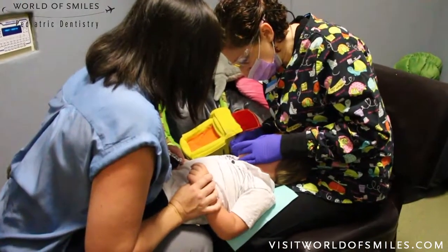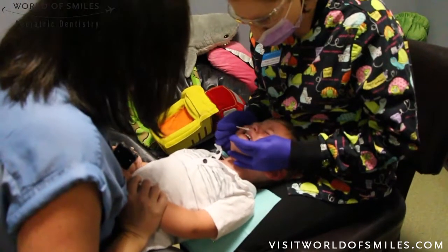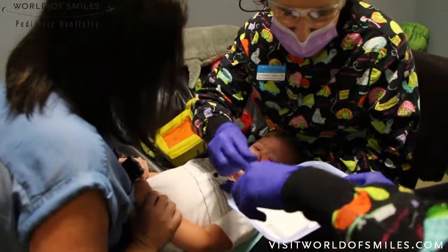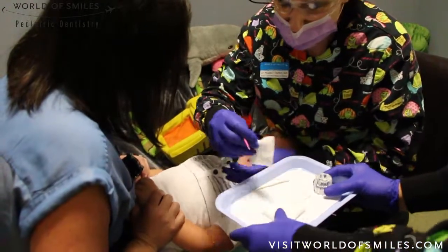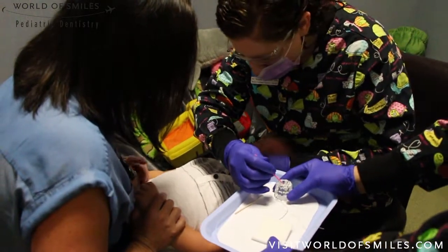To isolate the field and avoid any staining, you can start by putting some Vaseline around the child's lips and even their face in order to avoid any unnecessary and unwanted staining from the silver diamine fluoride. You can even use it on the gum tissue. Use a 2x2 or an air water syringe to dry the teeth you'll be treating, and keep the area isolated.